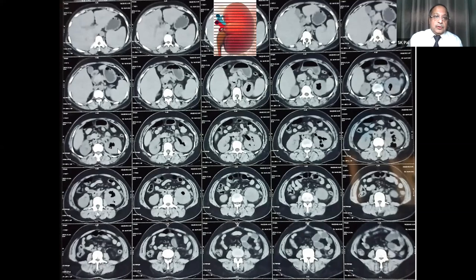But as you come to the middle pole of the kidney, now there is no spleen seen and the window is opened up. Now you can see, you can puncture the kidney from so much of area from the back. So from this much of area. Similarly, on the right side, you can see in the first 5 cuts, there is liver almost encircling the kidney. From 6th cut also, there is liver seen. 7th also, the liver is seen. From 8th cut, now the liver is remaining up and the kidney is now the lower pole, and the middle pole of the right kidney can also be approached from the right side. So like this, you have to study from which particular area you can enter the kidney.